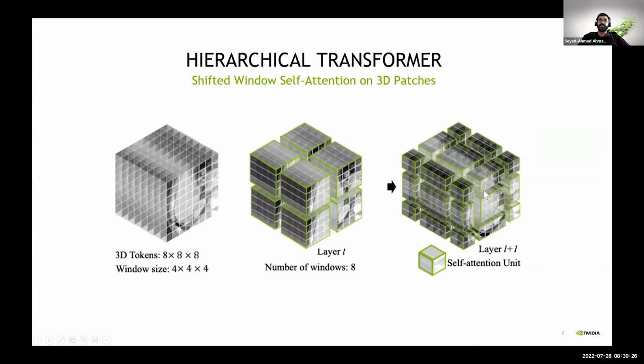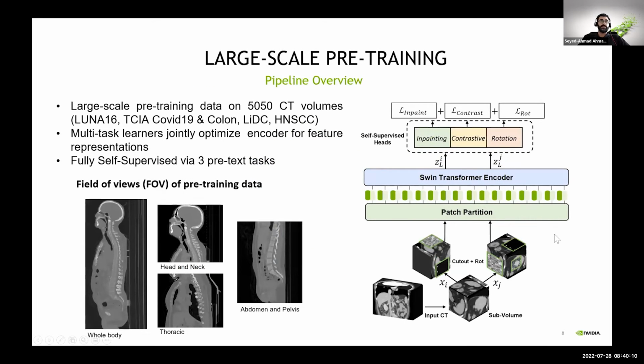For doing this, the next layer of multi-headed self-attention is again on windows, but these windows get shifted by 2 patches. And you can see this here. Now the center patches can compute their multi-headed self-attention to each other, bearing in mind that they already established their multi-headed self-attention in the previous layer. This is similar to how we do convolution with strides. We increase the receptive field of the multi-headed self-attention by shifting the window by 2 blocks. This is the second layer of multi-headed self-attention with the shifted window, in order to establish the longer range spatial context. This is the one trick in this work, introducing the concept of SWIN transformers, which was proposed by Microsoft researchers in the computer vision domain, but now fully in 3D for 3D vision transformers, and by extending the previously proposed UNETR architecture.